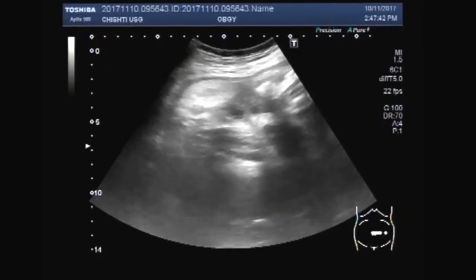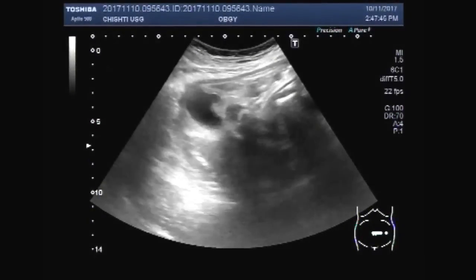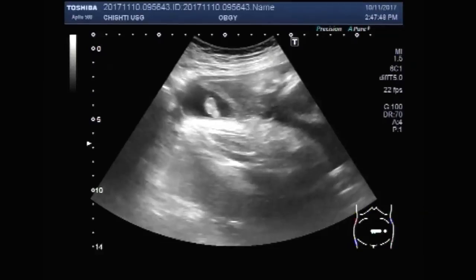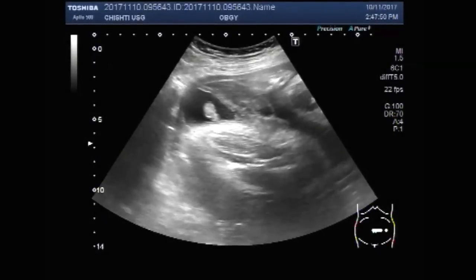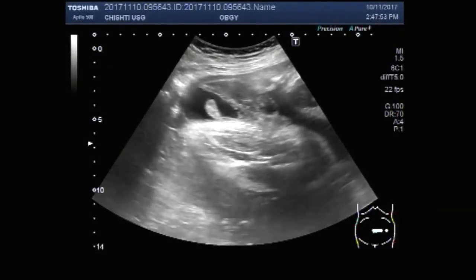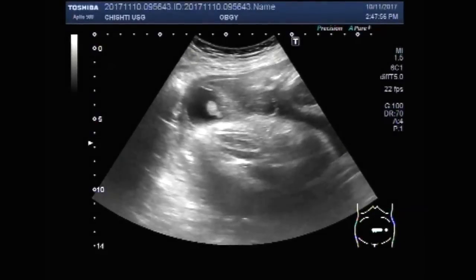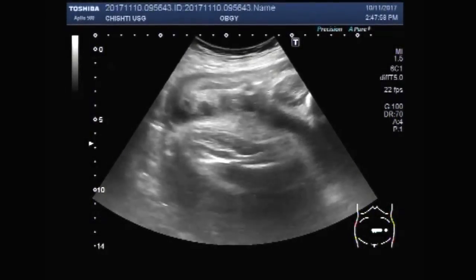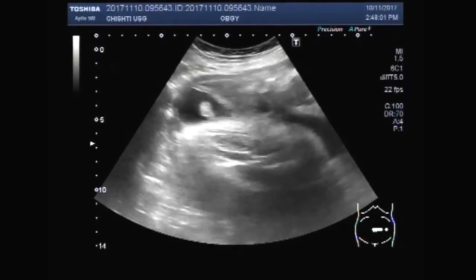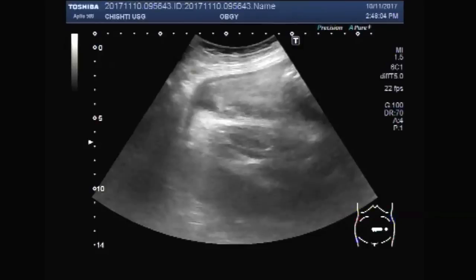Again, you can see the testicles. One testicle is seen in the scrotal sac, and the other scrotal sac is empty.